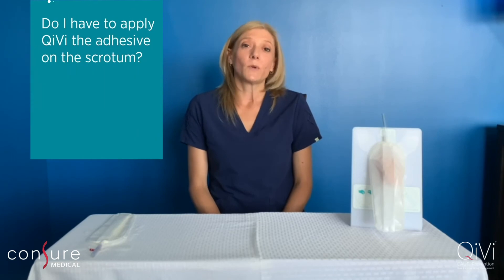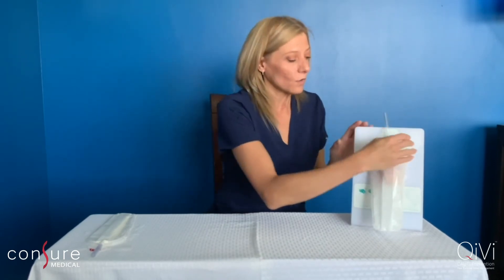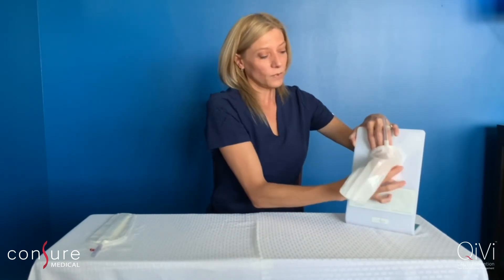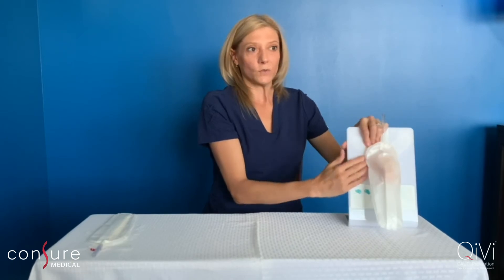Is the adhesive supposed to be placed on the scrotum? Yes, it is supposed to be placed all the way around the anatomy. So whenever you're smoothing it out, you want to make sure you go all the way around and place it on top of the scrotum. This will ensure you have a closed system.